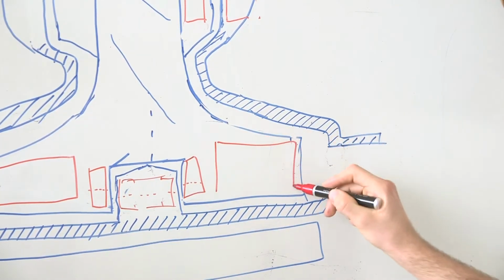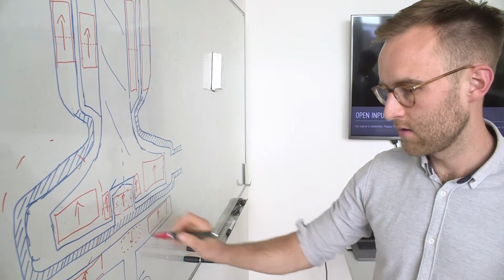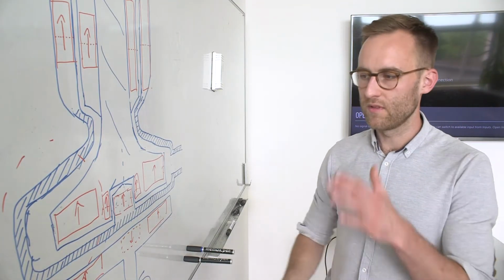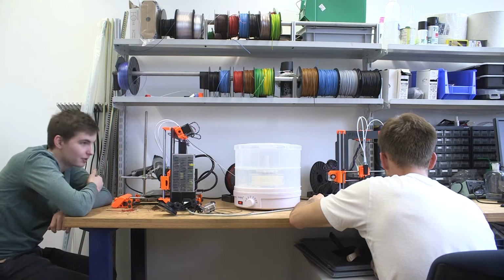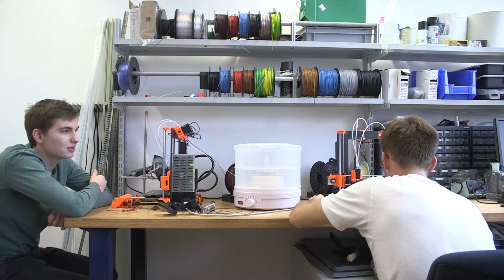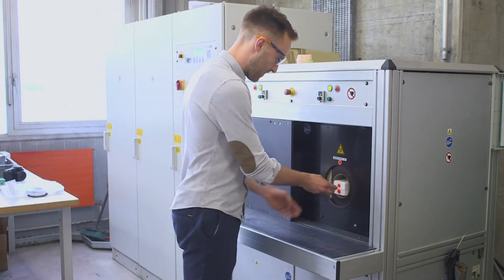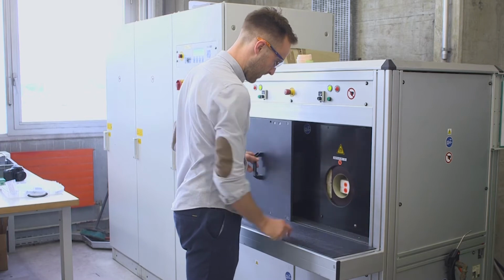To print them directly into the parts while printing the pump itself, we developed a process that we call embedded magnet printing. We are printing a filament of a magnet powder polymer composite in a conventional fused deposition modeling printer and then magnetize the part in a strong magnetic field.